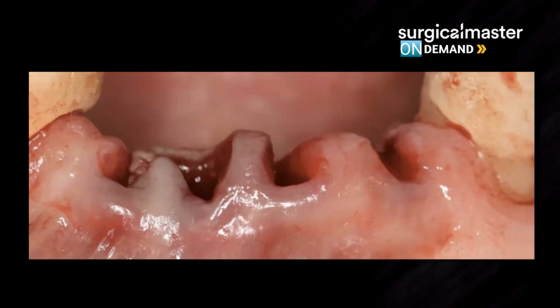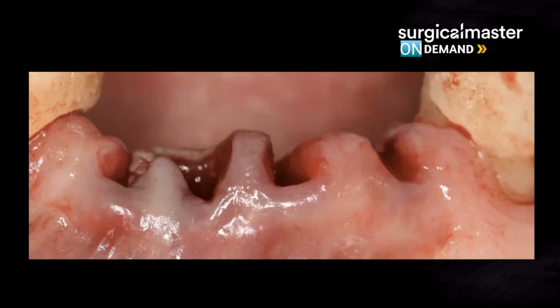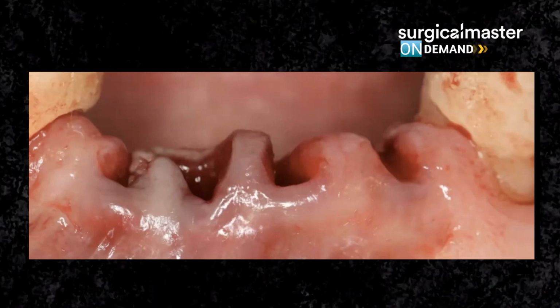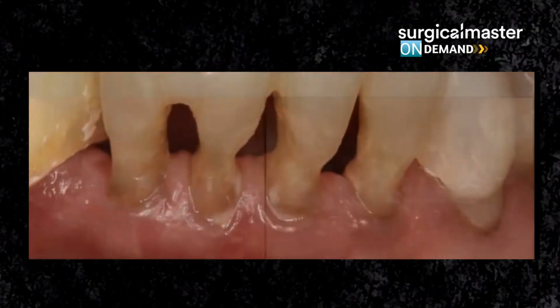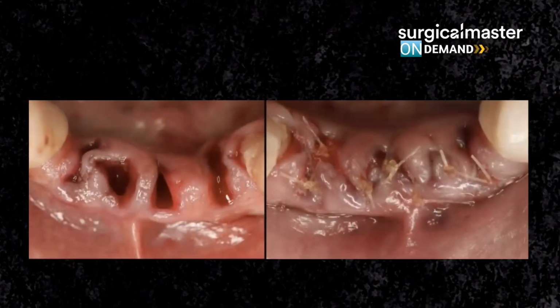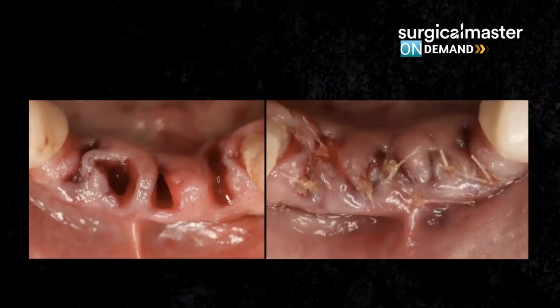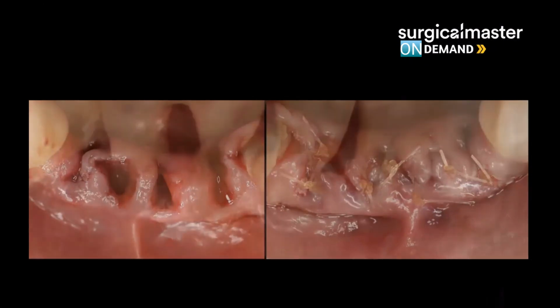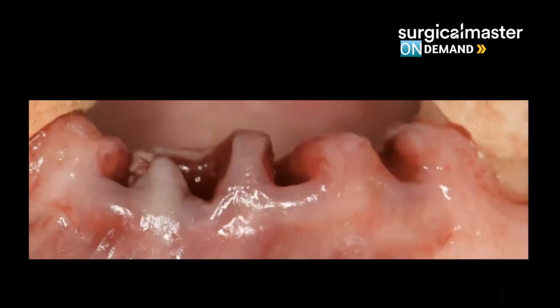And the doctors on this training that have the aspiration to be excellent at suturing, there's another way to do it. There's another way to get a nice result where you can suture in primary closure, primary intention healing, getting rid of the excess tissue without cutting it away, without needing to worry about it later on. So how do we do it?